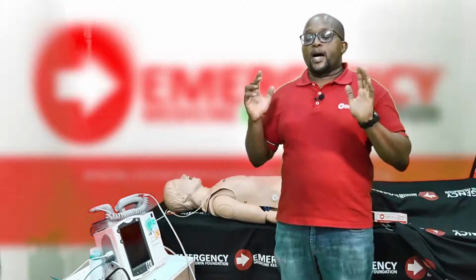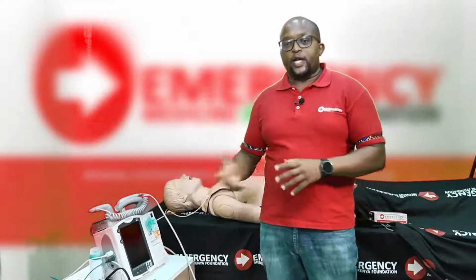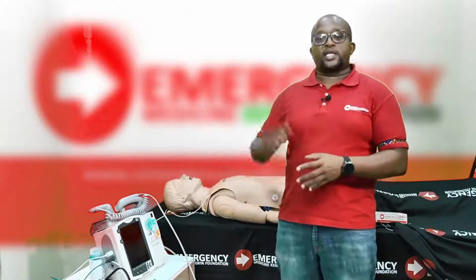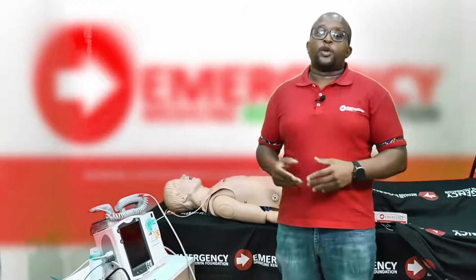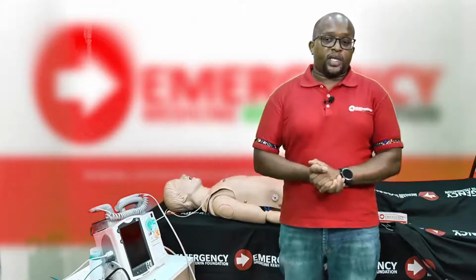The second major difference, of course, is if your patient is alive, then we're going to use less energy on your patient, and we'll discuss the different energy levels we'll use, because we don't need that large amount of shock to be delivered to the patient because they're alive.